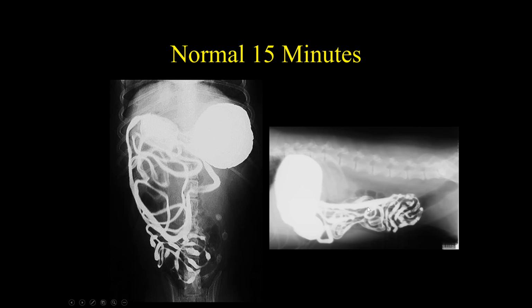Okay. What you're going to look for is a region of bowel that is dilated, or there's a filling defect. There's a part of the bowel that doesn't have contrast in it, doesn't fill with barium. Okay. That's typically what you're going to look for.